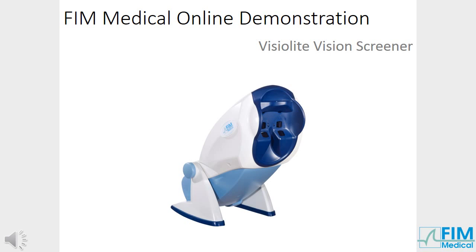FIM Medical is pleased to welcome you to its online demonstration. This video will demonstrate all the advantages of the Visiolite Vision Screener.